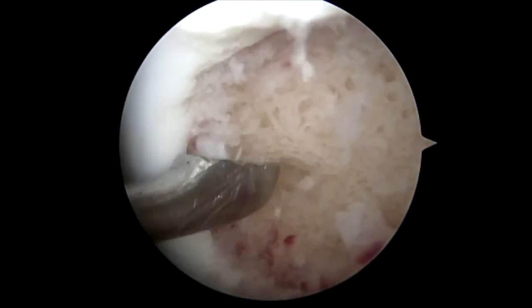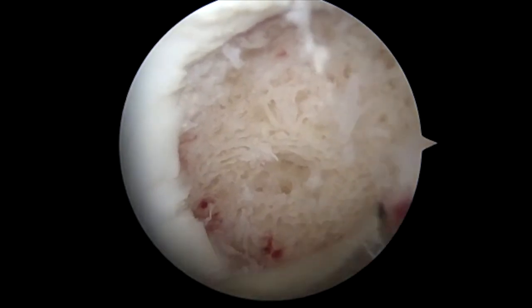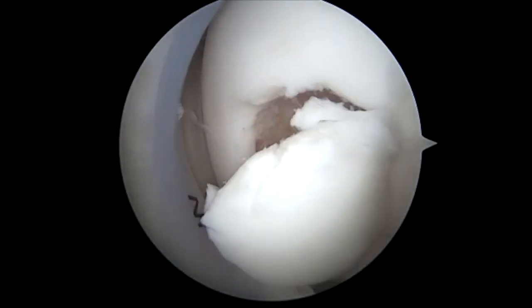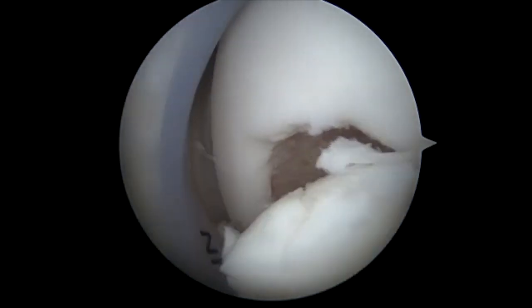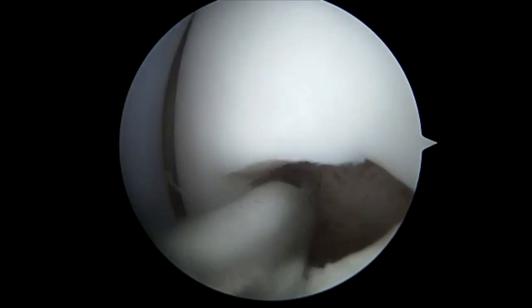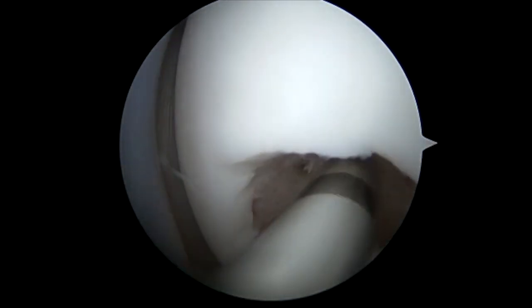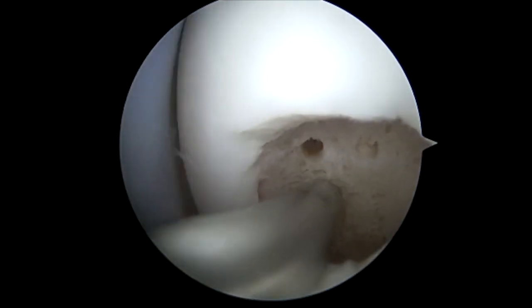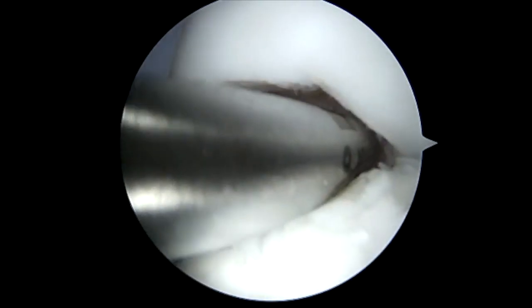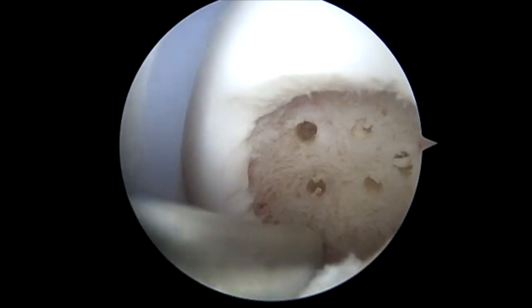Following this, we place a shaver back into the joint to clean any remaining loose pieces. Following this, we use a power pick to make small microfracture holes. This tool allows us to not only hold the hinge open, but to make appropriately symmetric holes.